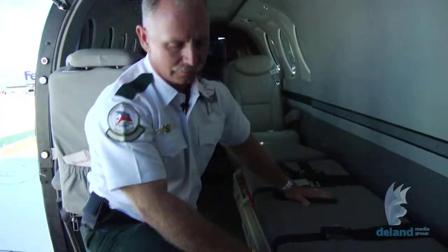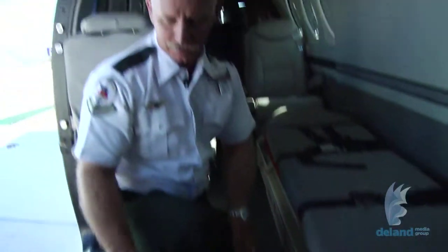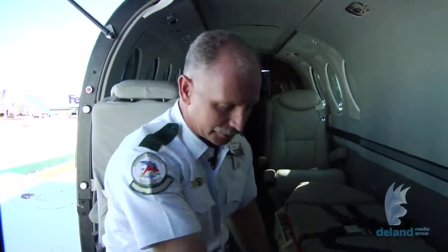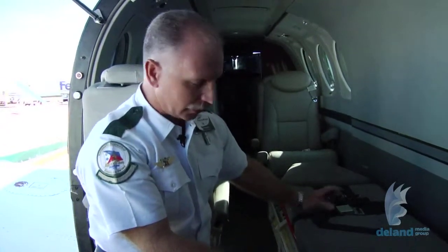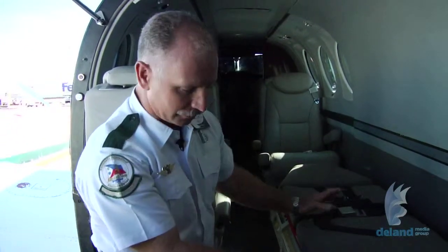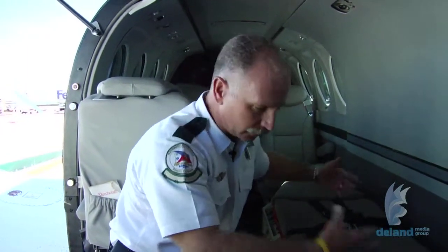Okay, this is what's called a life port medical sled. The base of this sled is designed to mount in the tracks of the airplane, same tracks that the seats mount in. And essentially it's secured in place, and there's a large power connector that connects to the plane's power. It also contains a large oxygen bottle that is filled from the outside, and that makes the sled basically self-contained. What happens is, once we have the patient on the stretcher, naturally there would be a sheet on it, there would be a pillow, the patient's comfortable.